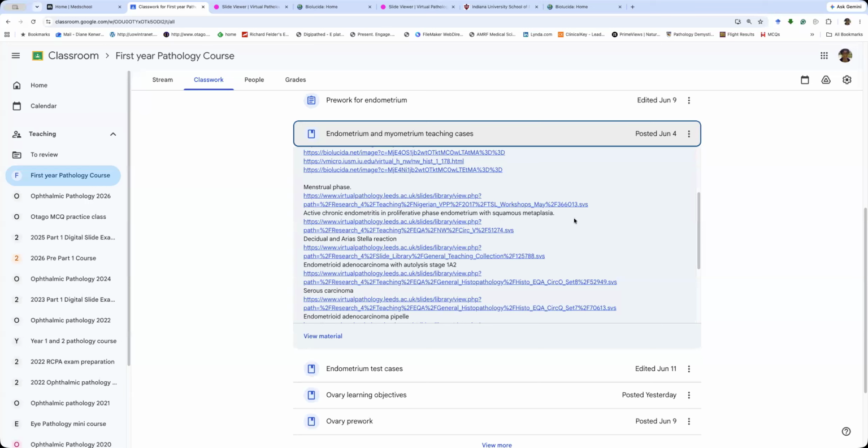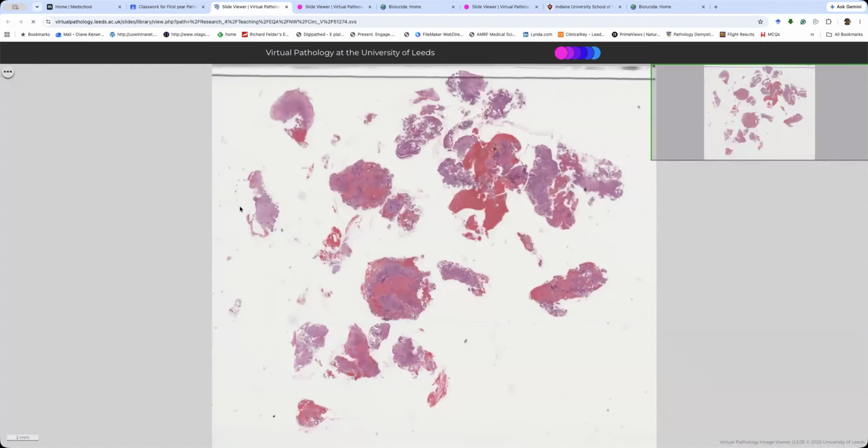All right. Now, this is the other problem with the endometrium. Several things can happen at once. You can get metaplasia in a normal cycle with some actual pathology. So let's have a look and think about clues about chronic endometritis. Chronic endometritis is common in postpartum. Yeah, when there's a bit of retained products, you'll see lots of plasma cells there in the endometrium.